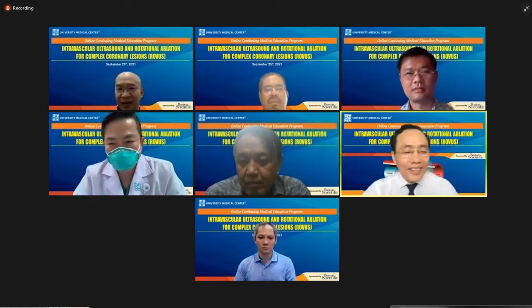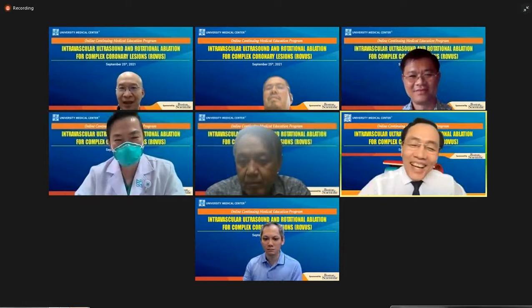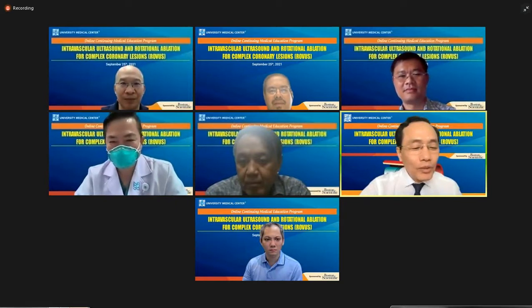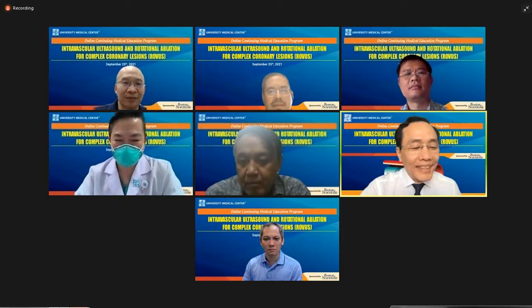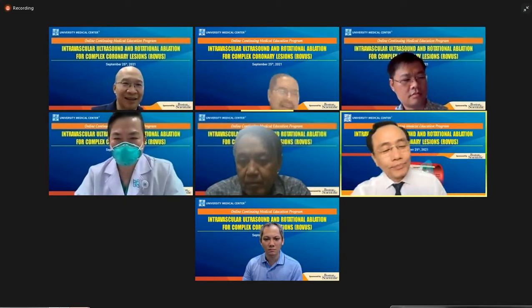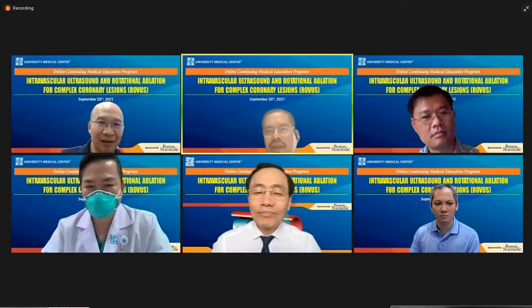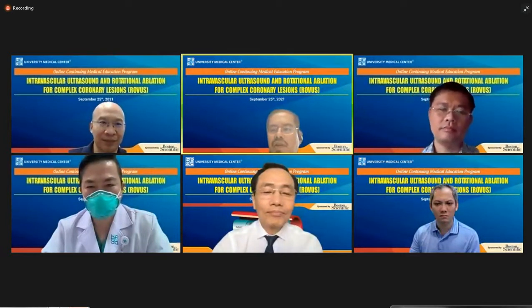Okay, we continue the CME now. What do you think about the case, Dr. Huang? Majority of us choose a provisional stent, but Dr. Wu did a DK crush. What do you think about this procedure? I think Dr. Wu already prepared for that. So everything you prepare carefully, the result will be better. So it's okay for the patient.